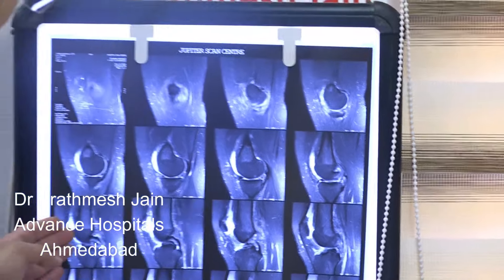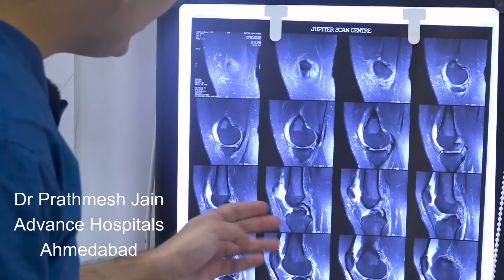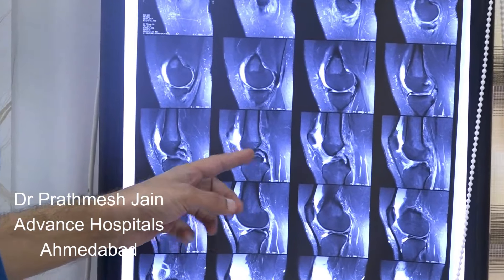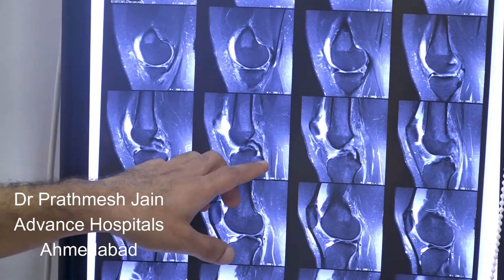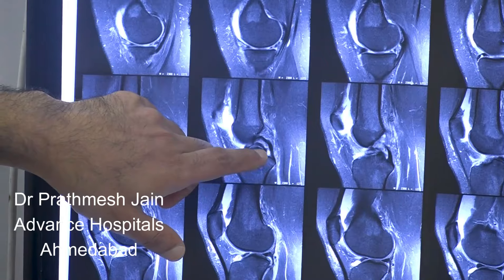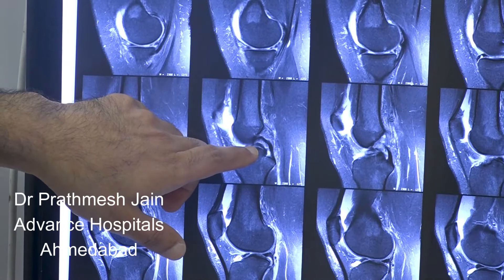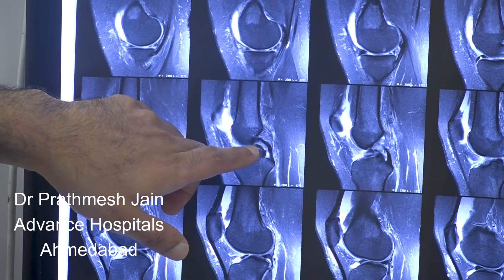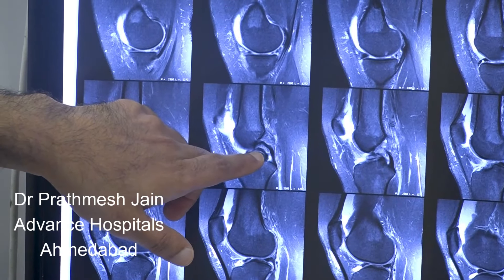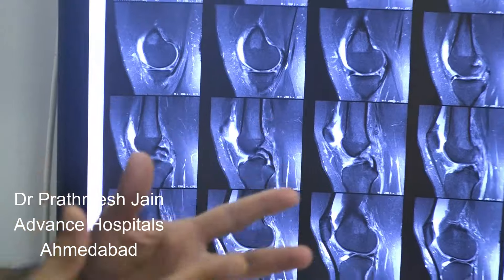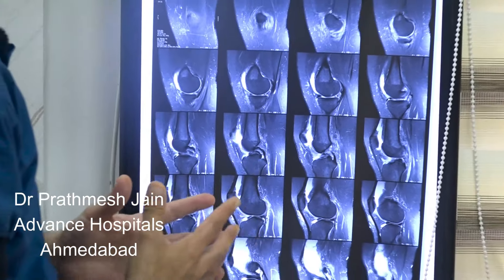When we go laterally, we can see a classical double PCL sign. This is the PCL and this is the medial meniscus. You can see the double PCL sign here, which is very classical of a locked bucket handle tear.